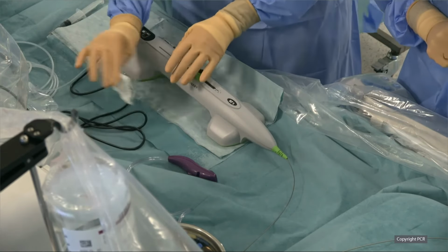Can you move to Javier's hands and do a lot of zoom? Okay. Yeah, you see the device. We want you to see the device, yes. First the crown. Okay. So this has the ability to perform sanding of the plaque antegradely and retrogradely. Then, if we go to the module that we're going to be using, and I'll have it here.